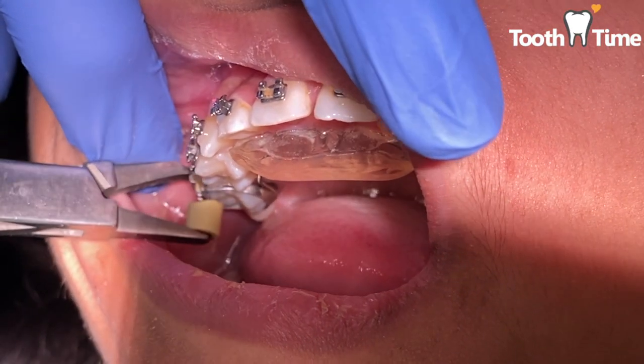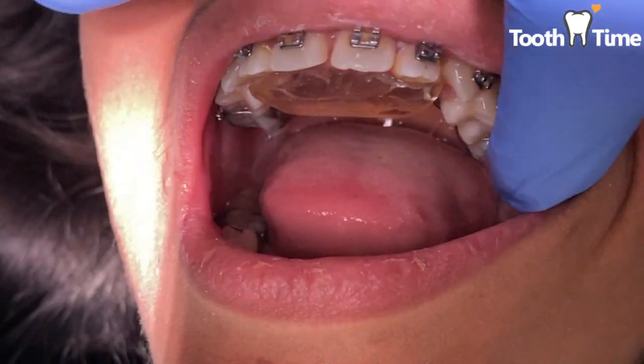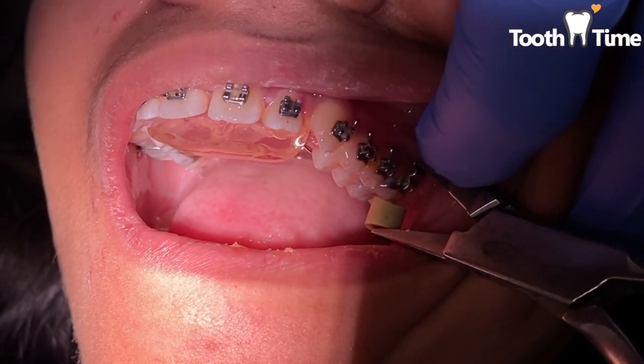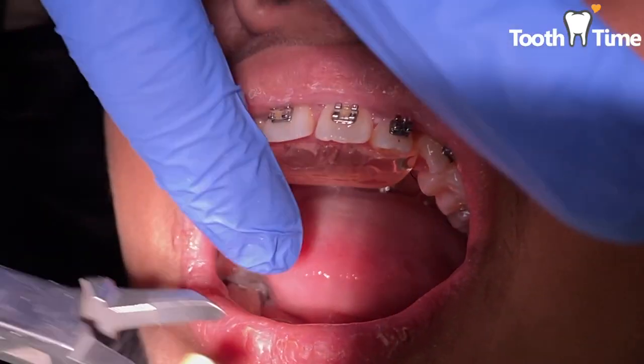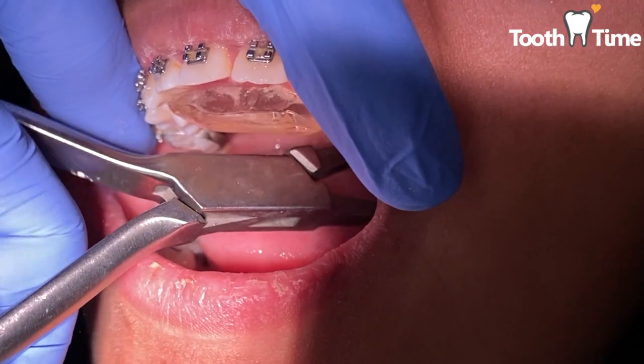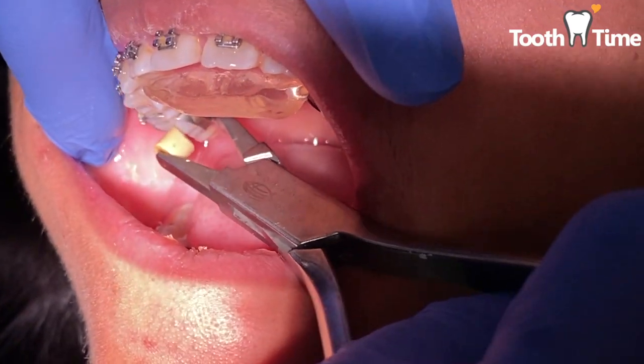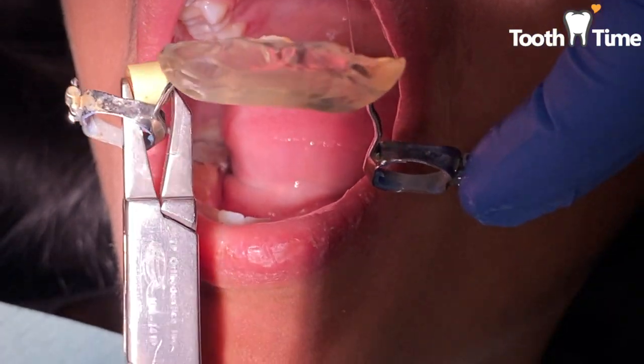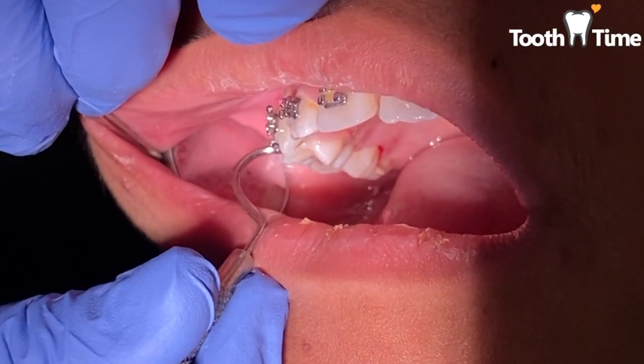See here, this patient has had a bite plate on for the last 6 months. It has done its course, so we're gonna go ahead and remove it. Now, you wanna make sure that you take off any of that plaque or any of the Fuji glue residue off to make sure that it's bonded back on correctly, which we will do.